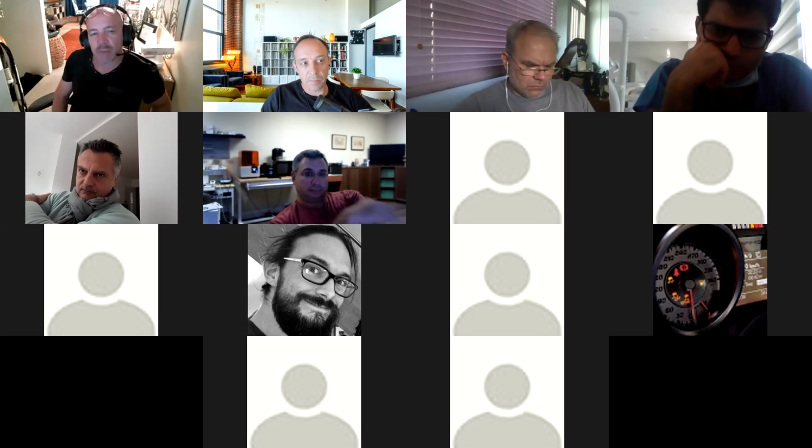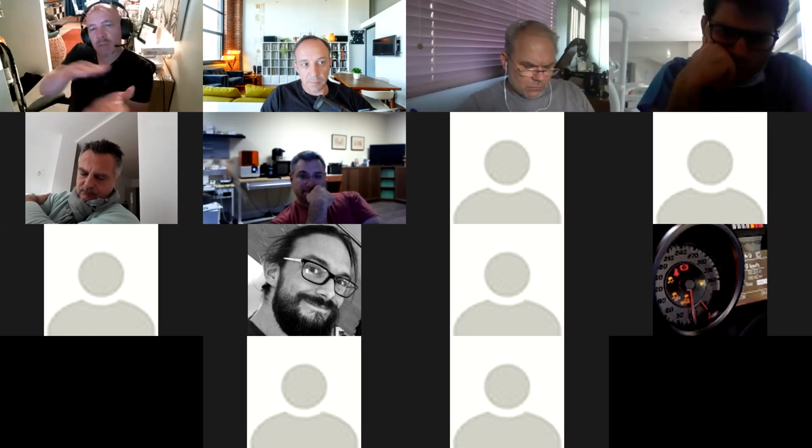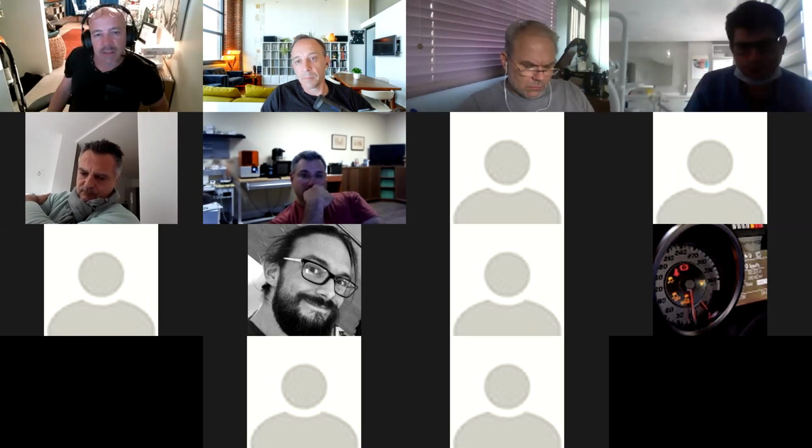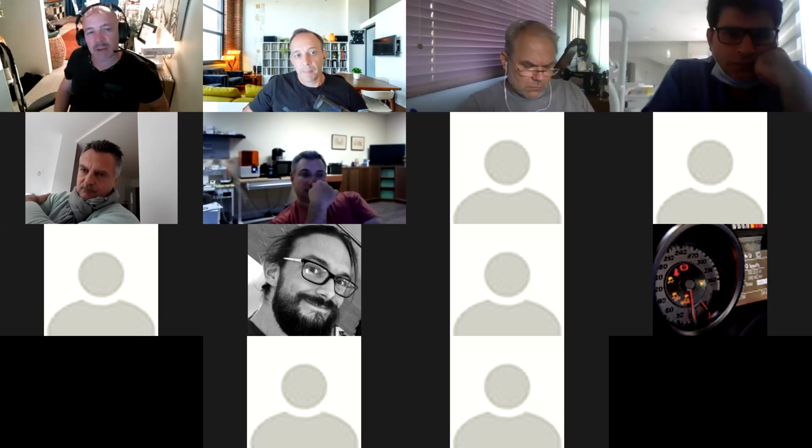Thank you so much. I reckon that would be really helpful in balancing the dentures later on. I think you're 100% correct. I didn't really think about that at this stage, because in the lab we've got a mounting table for the articulator, but I think that's really very cool. And all I need to do is change the shape of the actual mounting table. Good, thank you.